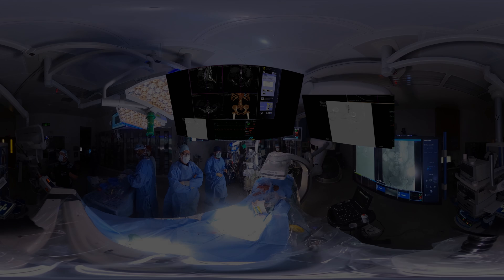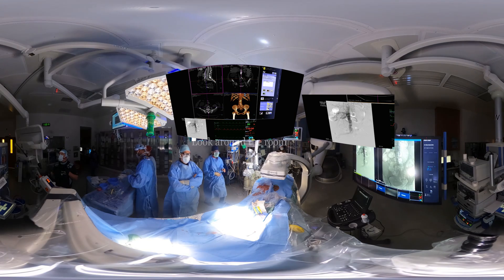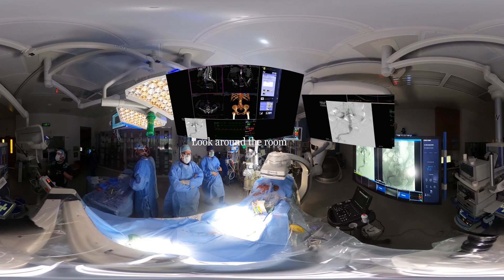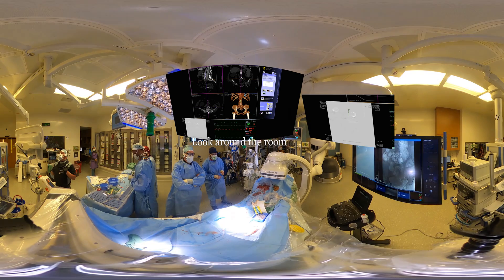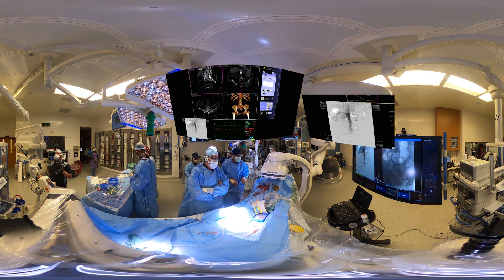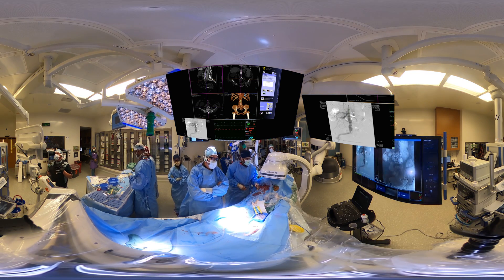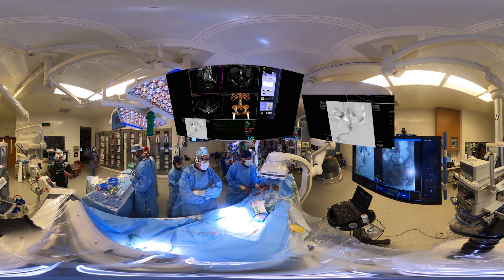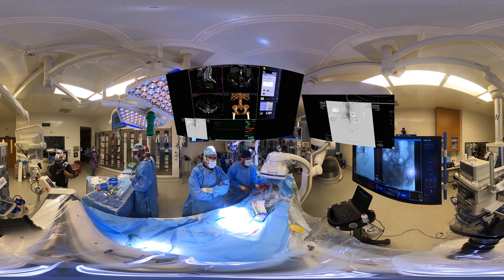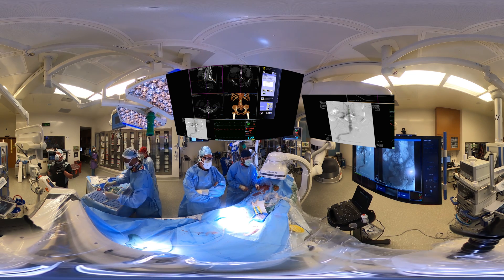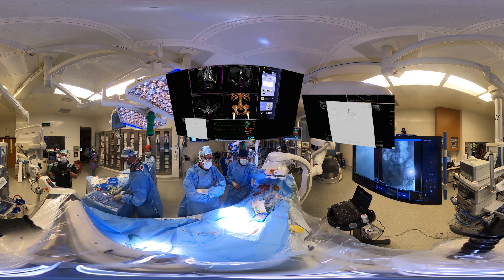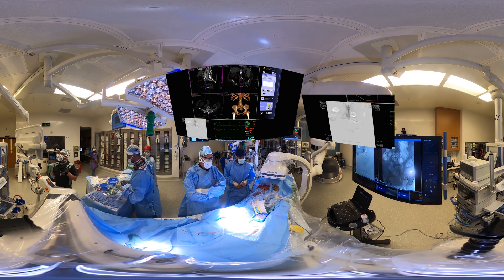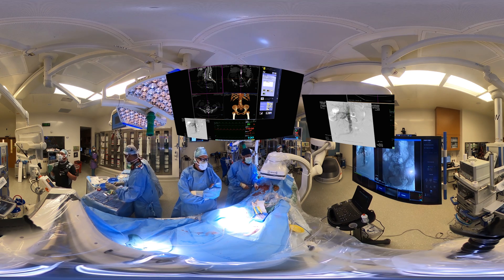Now let's join as we film this in 360. This environment allows you to actually look around the room at the various different monitors and the various different personnel who are present. We can actually drive around this room, and we're looking to see the benefits of 360 filming in areas that we can highlight.